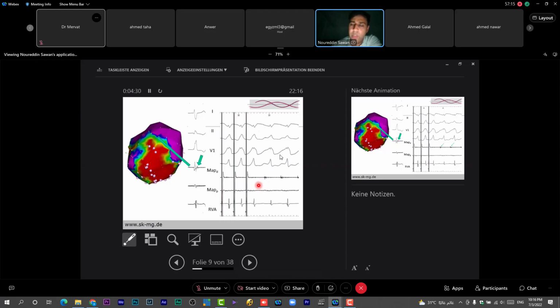However, be cautious when you see in some papers or books presystolic potentials or mid-diastolic potentials. These names are very controversial and differ from author to author. You have to be very cautious. But in my opinion, mid-diastolic potentials is the most correct name for these signals.